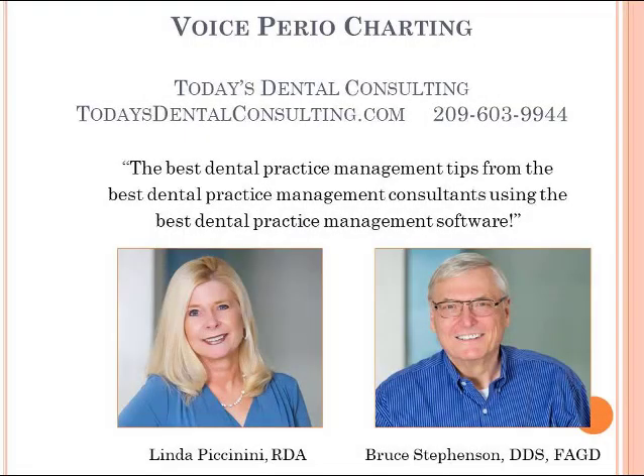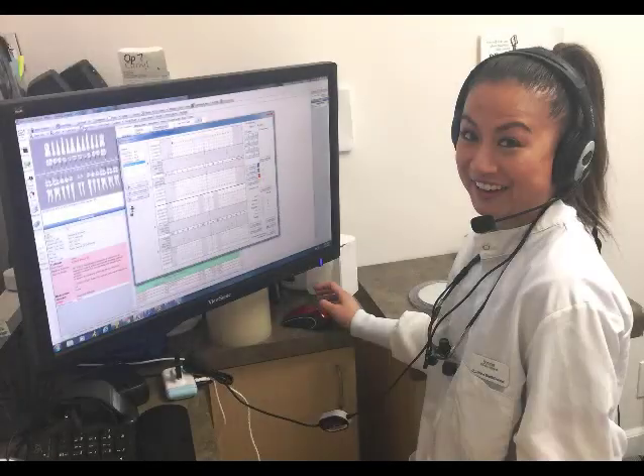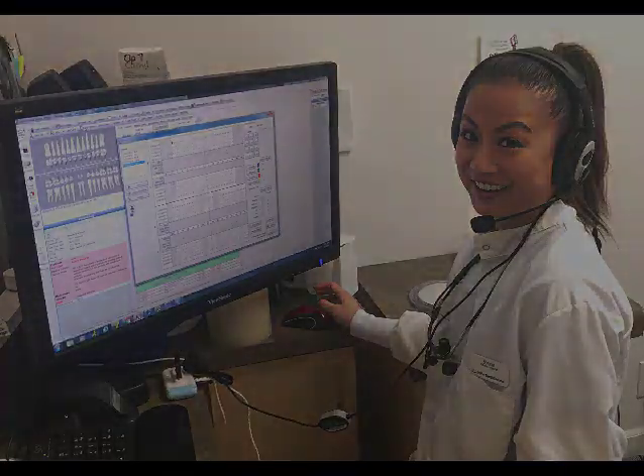I have re-edited a video I did previously on the voice perio charting in Open Dental. This feature is now included as a standard part of Open Dental. All you need to buy is a microphone, and I'll come to that in just a second.